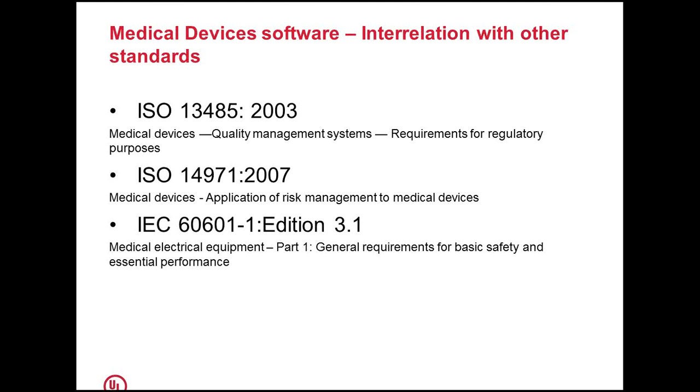So that's why there is a standard on how to go about risk management for medical devices. And if the medical device is electrical equipment, of course, whenever there is software, this is considered a medical electrical equipment, and the requirements to be fulfilled are in IEC 60601-1. The current edition is edition 3.1. So these three standards discuss the software part of it.